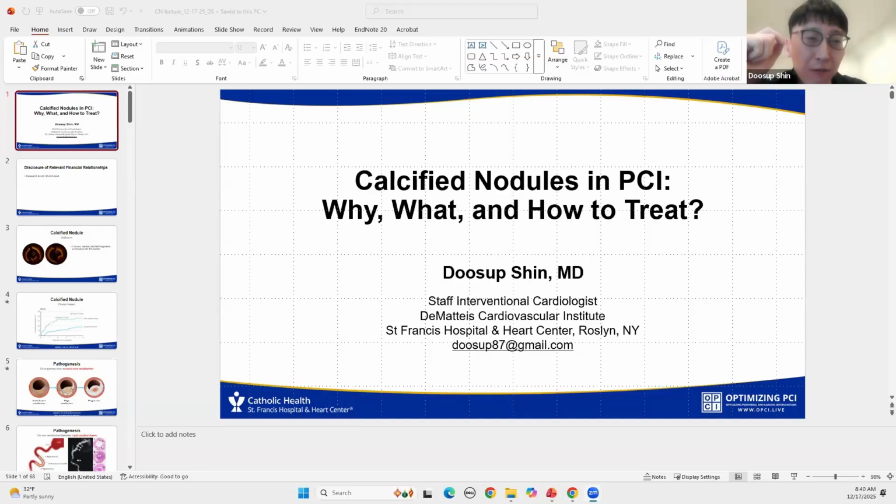Another thing is the financial issue. It's very difficult for us to use two IVL catheters in one case in the US, unless you want to invest a lot of money. However, usually I think after 120 pulses, that's probably the maximum benefit that you're going to get. Another thing is IVL is great, but it also has limitations.